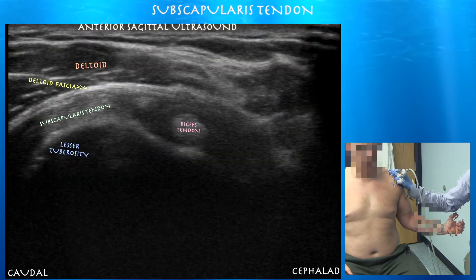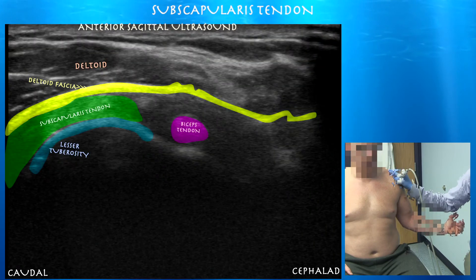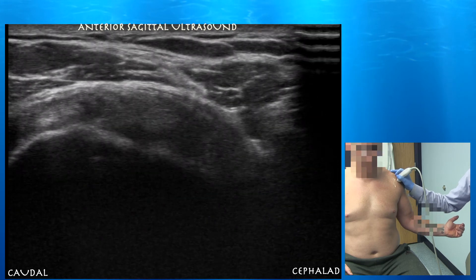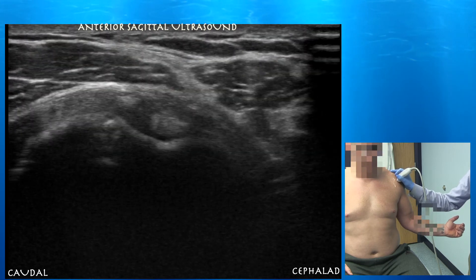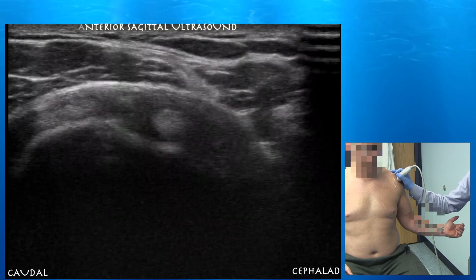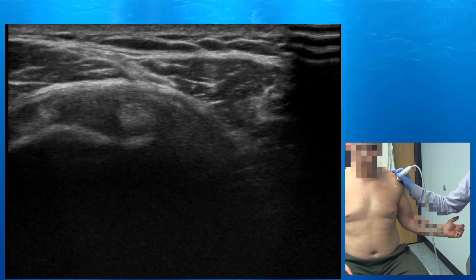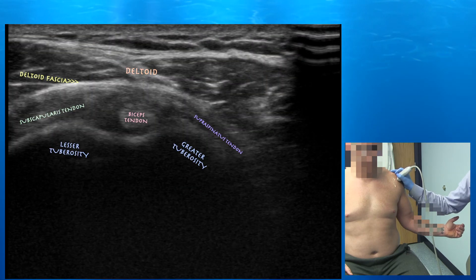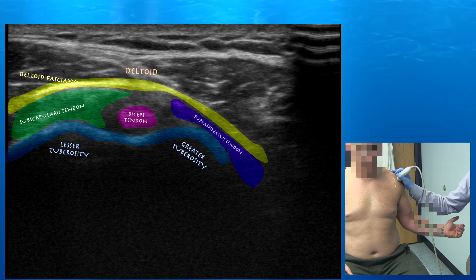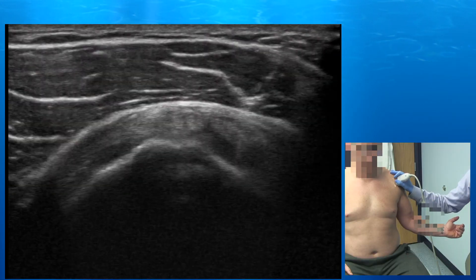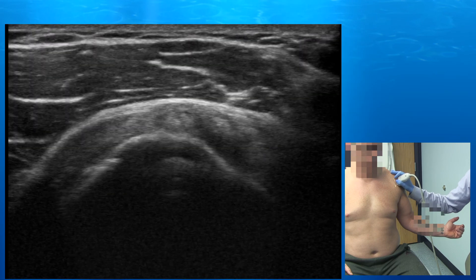As you go superior, your probe is essentially in a sagittal plane, but the biceps tendon curves around so you can actually see the biceps tendon in a cross-sectional or short axis view. Anything to the right of that, you're going to start getting into the supraspinatus. So here you're in a short axis view to the subscapular tendon and also a short axis view to the biceps tendon. We'll move into the biceps tendon next.